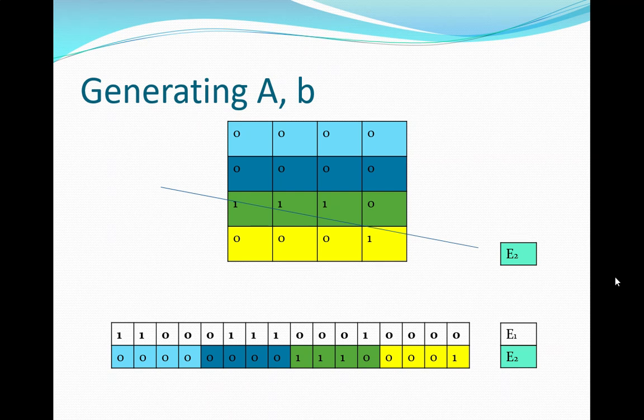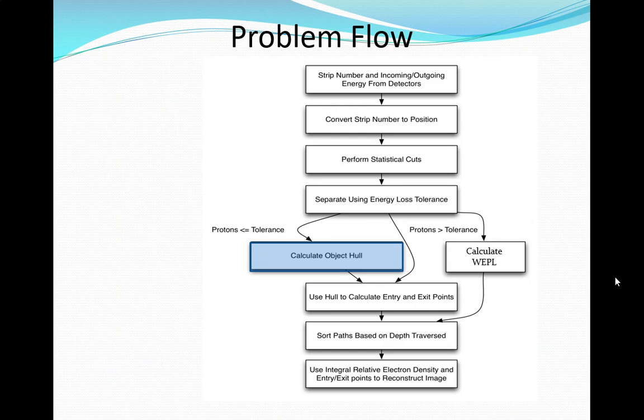Are you, for the sake of simplicity, considering a linear path, or can you do curve? You have to do curve. Okay, great. So it's linear through air. We'll project it to the boundary of the object, and then inside we'll do most likely path. And we'll know where it entered into the object, and we'll show you how to do that in like 1 sec. We're actually at our time, but it'll only take a sec to show you this last part.